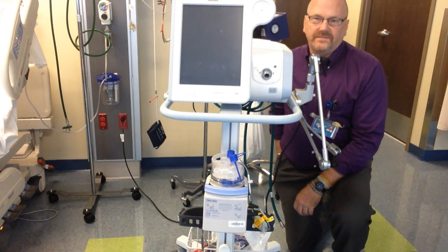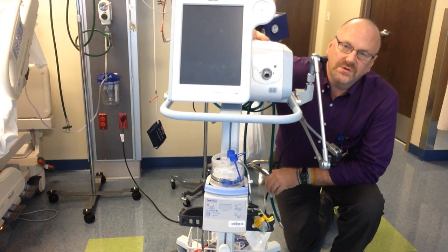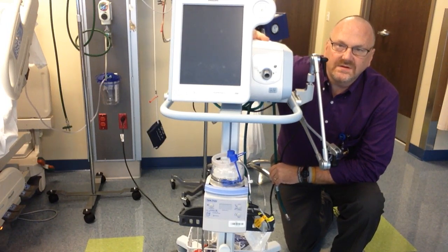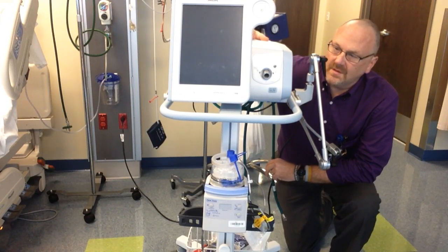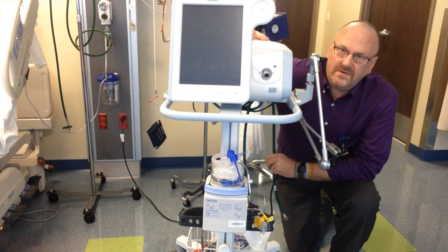Today we're going to be talking about the V60 Non-Invasive Ventilator. The V60 can be utilized to deliver what is commonly referred to as BiPAP. It can also be used for CPAP. It can also be used for invasive ventilation on both endotracheal tubes and tracheostomies. It is a pressure ventilator, time cycled. So you cannot dial in a volume, you are delivering pressures.